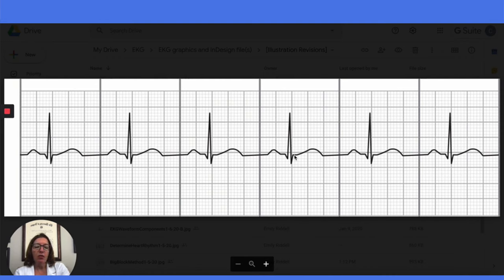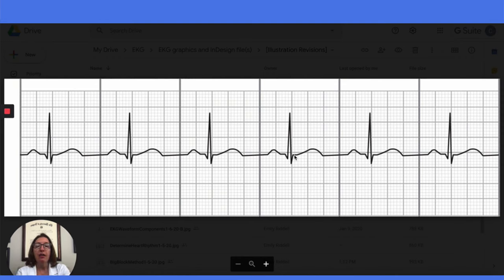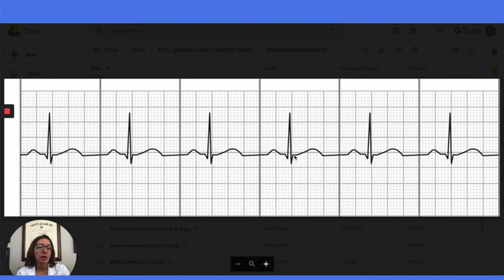So this is how we know we have normal sinus rhythm. Because, as you may recall, the key characteristics of a normal sinus rhythm include P-waves that are upright and uniform in appearance, and there is always a P-wave followed by a QRS complex. So this is normal sinus rhythm — we wish all our patients had this for sure.